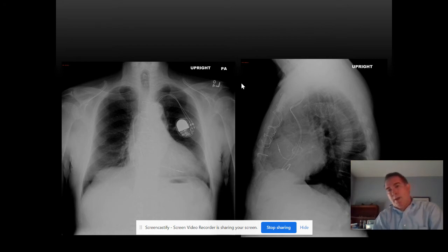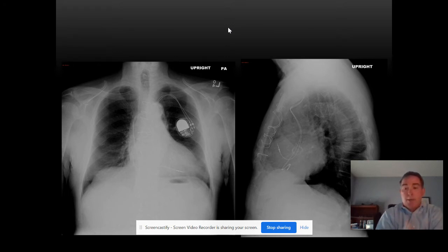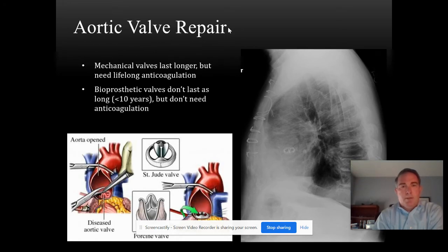Again, on aortic valves, this particular valve with this little three little crown looking thing, they could ask you in a testing situation, is this person anticoagulated? Would be kind of a nasty question, but it's out there. And the intent is that you know the difference between a full metal valve, which is this one, or tilting disc valve, versus this bioprosthetic crown looking one. The bioprosthetic crown looking one, this is a pig pericardium or something that they make that out of.